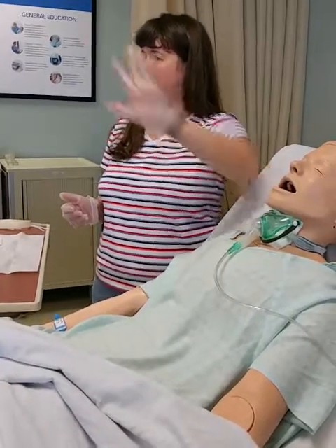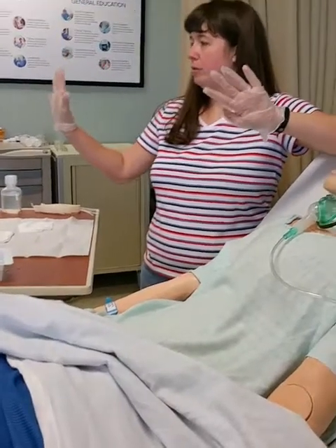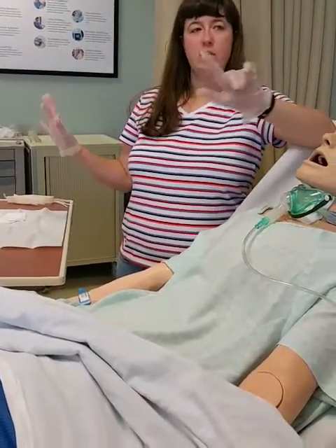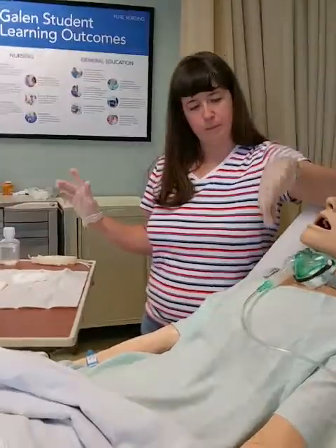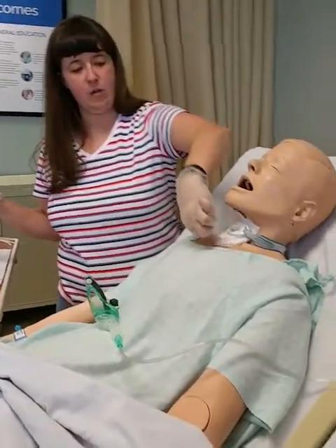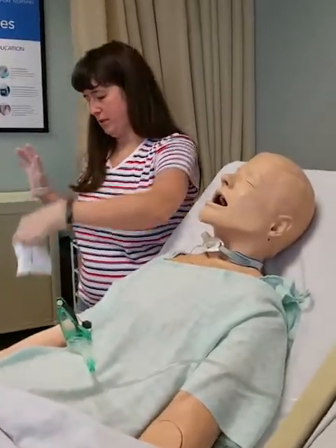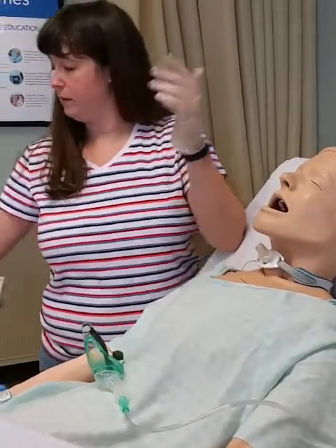But think about it. This hand is gross. This hand is still sterile. So do anything you still need to do that is like gross with this hand. So I'm going to take this off. Pull out the old disgusting drain sponge because it's going to be nasty.